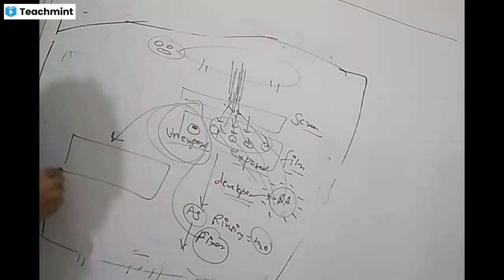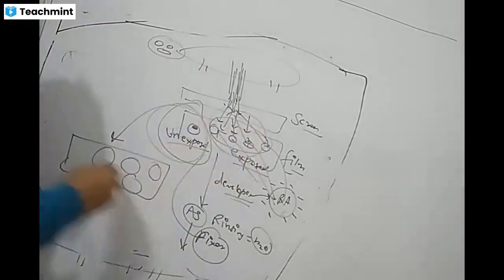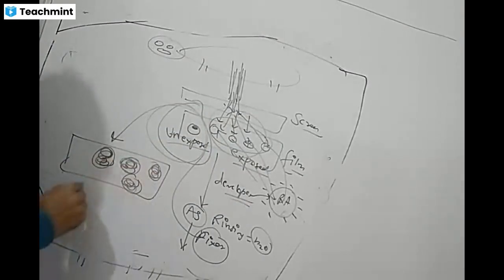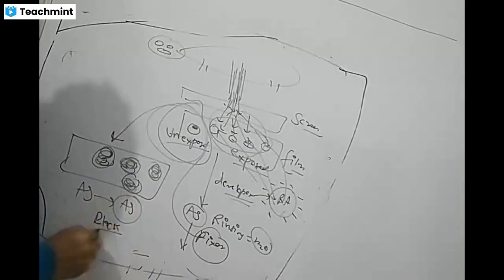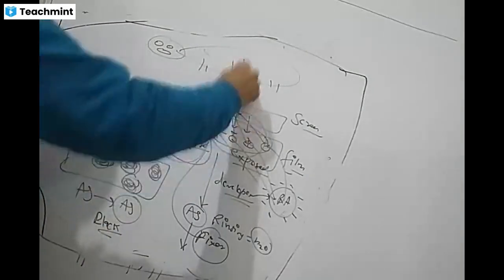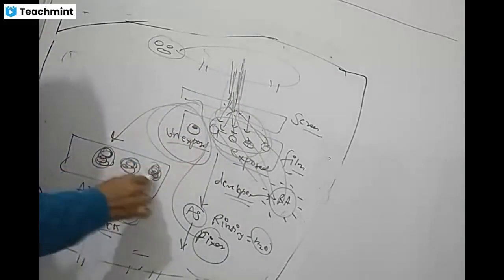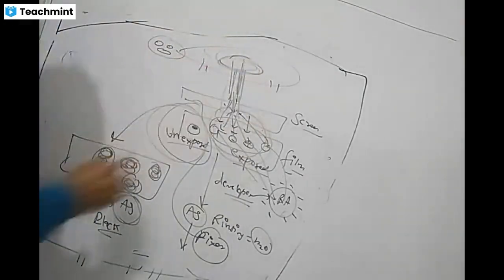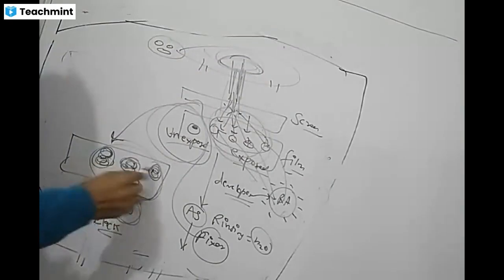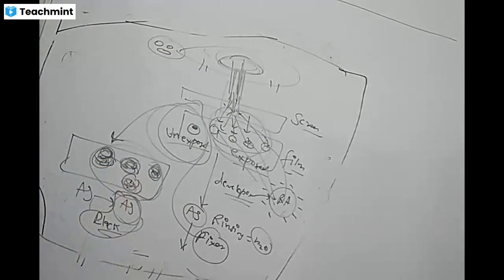So now you will get only these four crystals, which have all the silver reduced to metallic silver, and it is carrying information because the photons from the patient fell on these four. These four are fully reduced. These carry the information from the part. Suppose this is a thoracic radiograph. It is carrying all the information in the form of these four spots. They are reduced fully, and you will get a black color film.